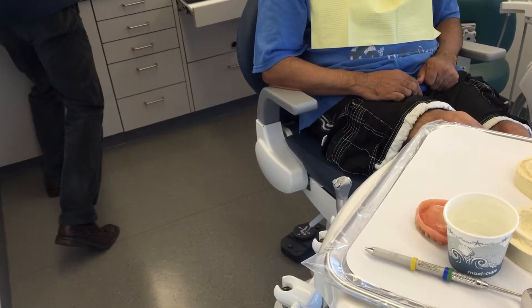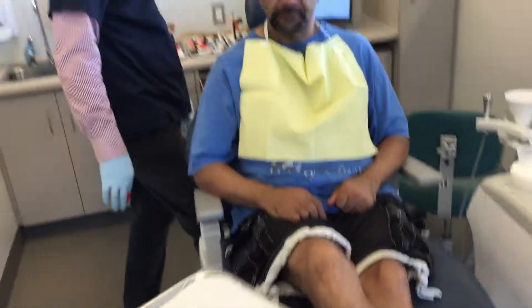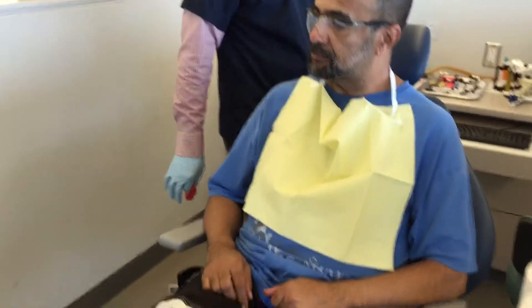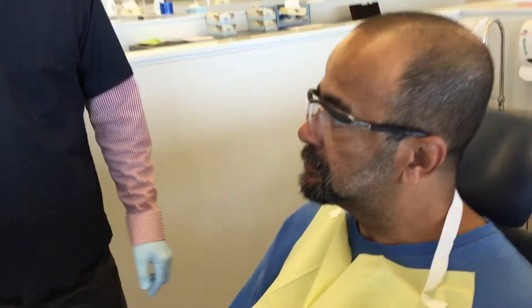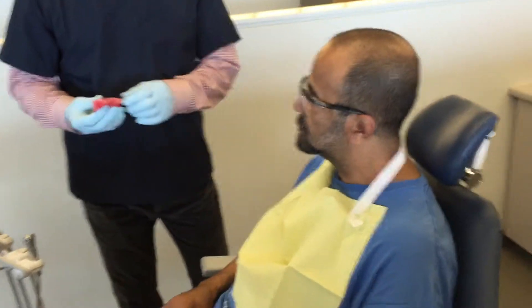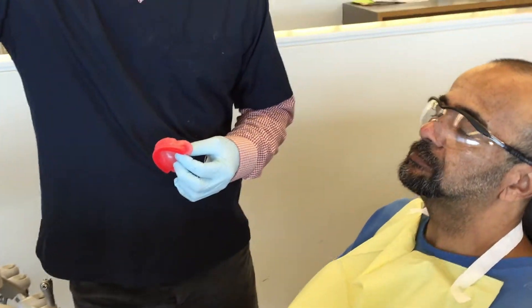This is where you start to realize the importance of a stable base plate, because if you don't have a stable base plate based on your final impression, and you don't have adequate suction at this point, it makes this part of the job very difficult.